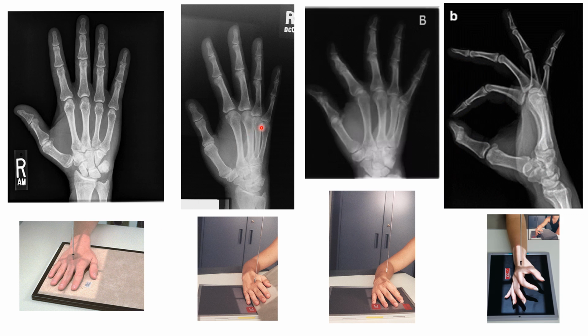Now the next image we're looking at is the oblique hand x-ray, and this one specifically is with the phalanges nice and parallel to the IR. So we have this positioning down here showing you how they've used a sponge to help the patient keep their phalanges nice and straight and parallel with the IR.